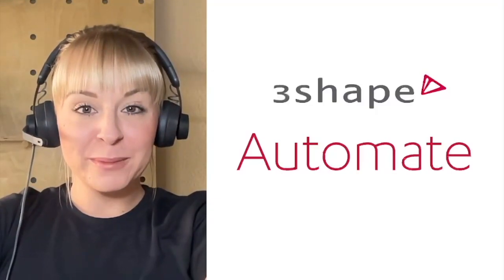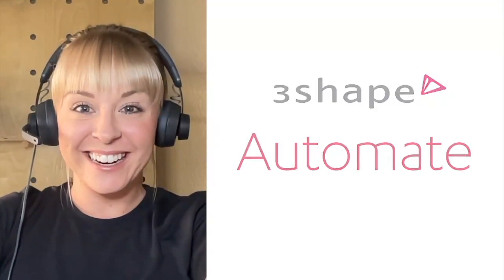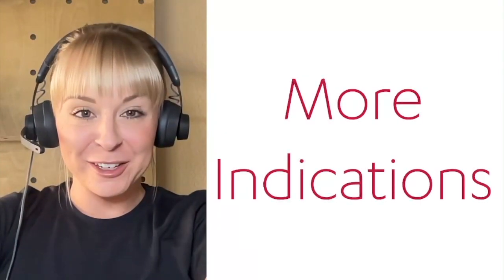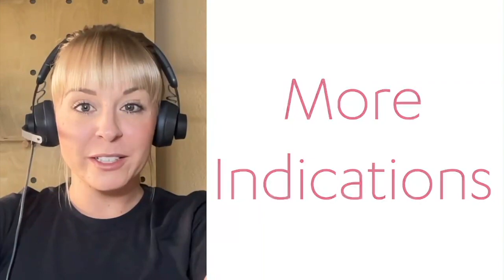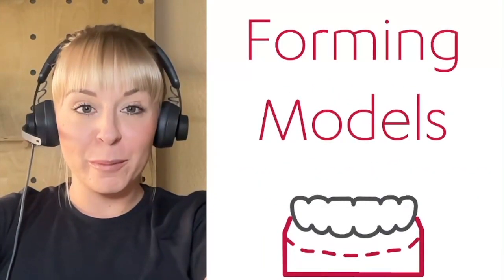Hi everyone, today we have a new update for 3Shape Automate — super exciting stuff. We are launching another new indication. Building off of our simple models that we launched a few weeks ago, we are now offering forming models.